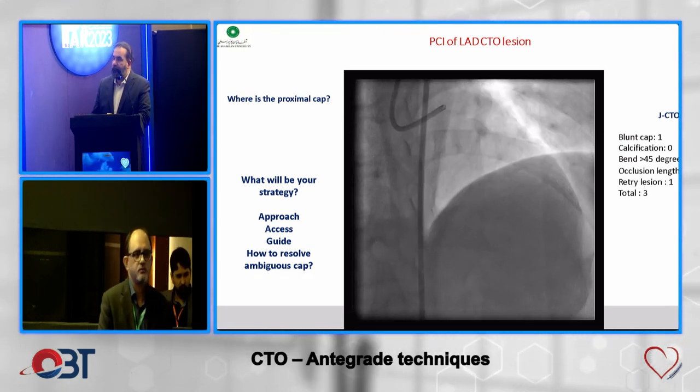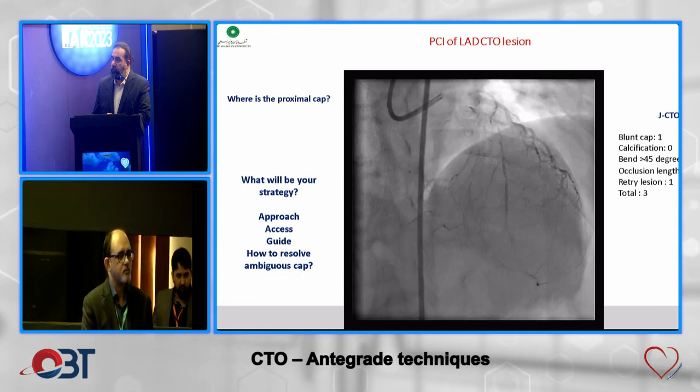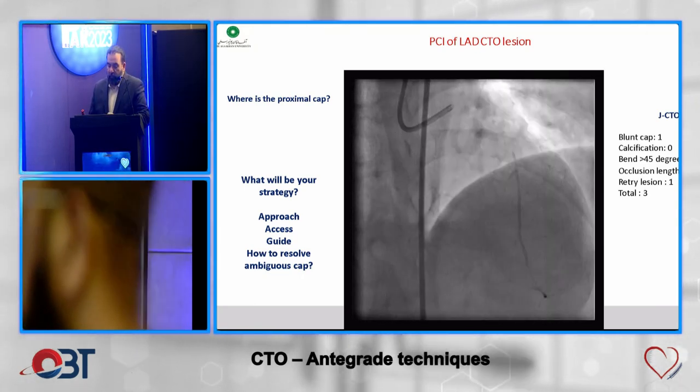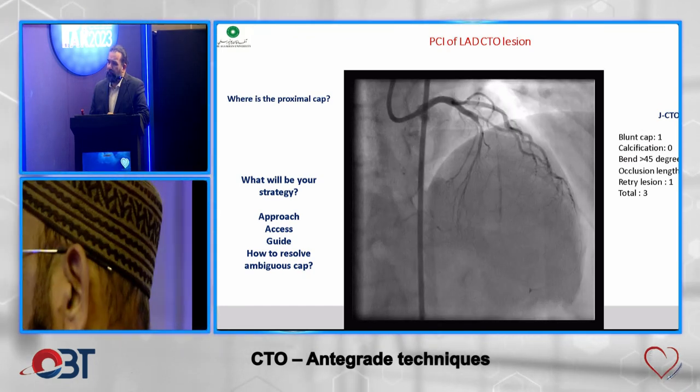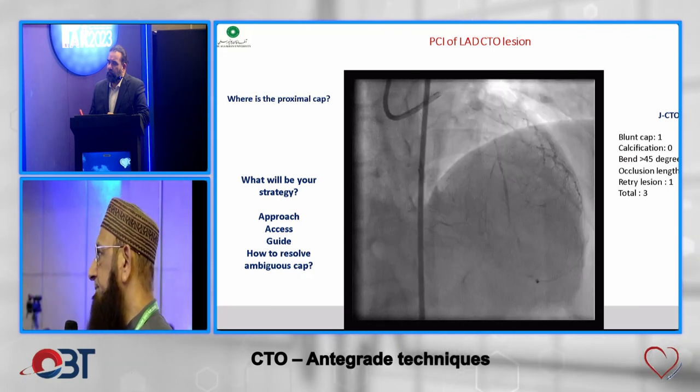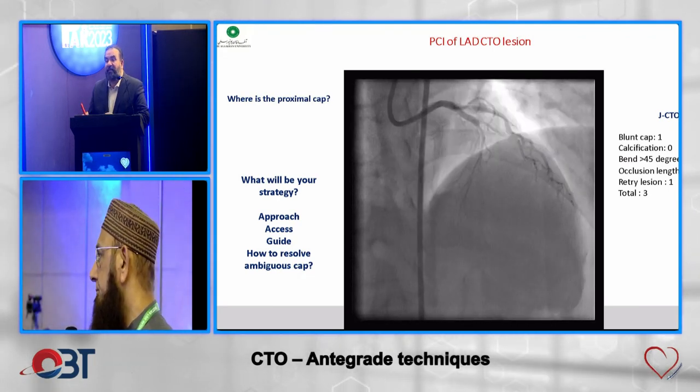Tarek bhai, aap. I will try first the antegrade approach as usually, because in retrograde there is no clear-cut collaterals visible. So my approach will be antegrade. Yeah. So, yes, sir.